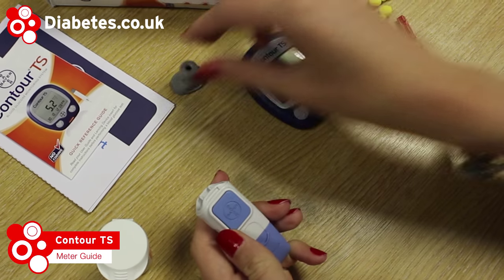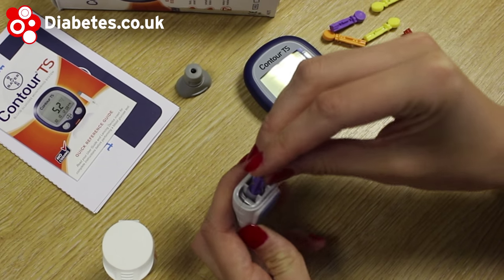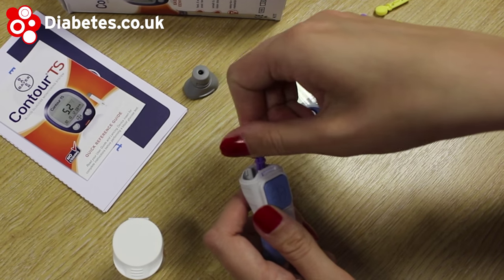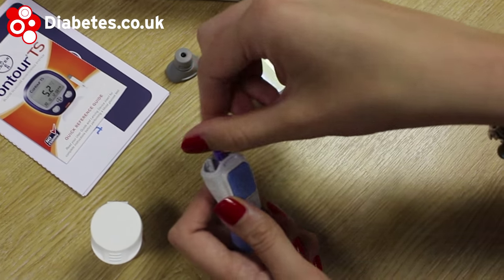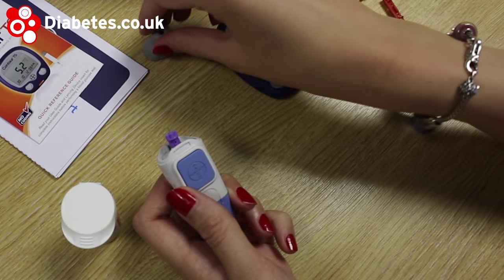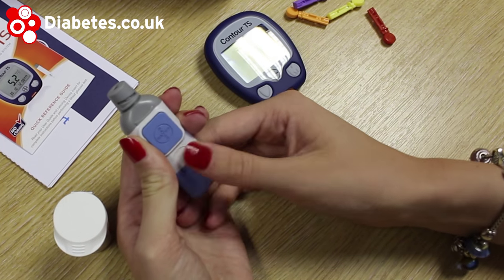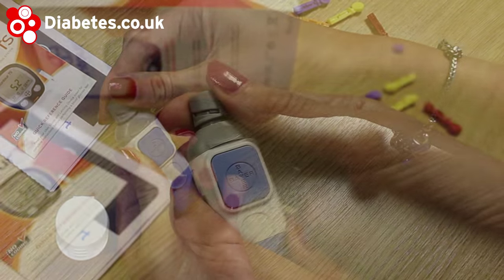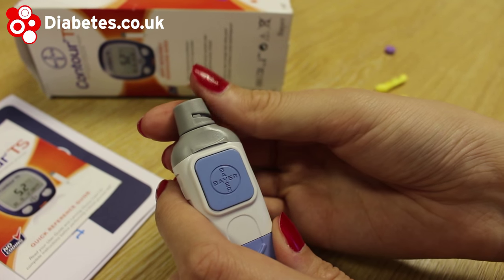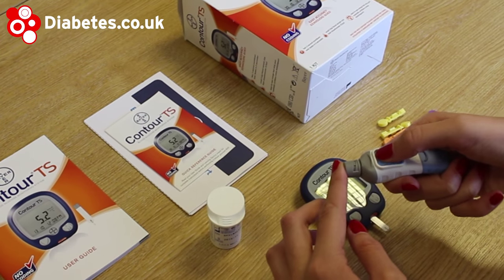Today we're looking at the Contour TS glucose meter, which is manufactured by Bayer. A key benefit of the Contour TS is that it does the basics without complicating things by having too many features. It is lightweight, and people with diabetes who are not treated by insulin should find it simple to use. You should also find that the Contour TS test strips are cheaper than others in the Bayer range, which will be very useful if you need to buy your own test strips.